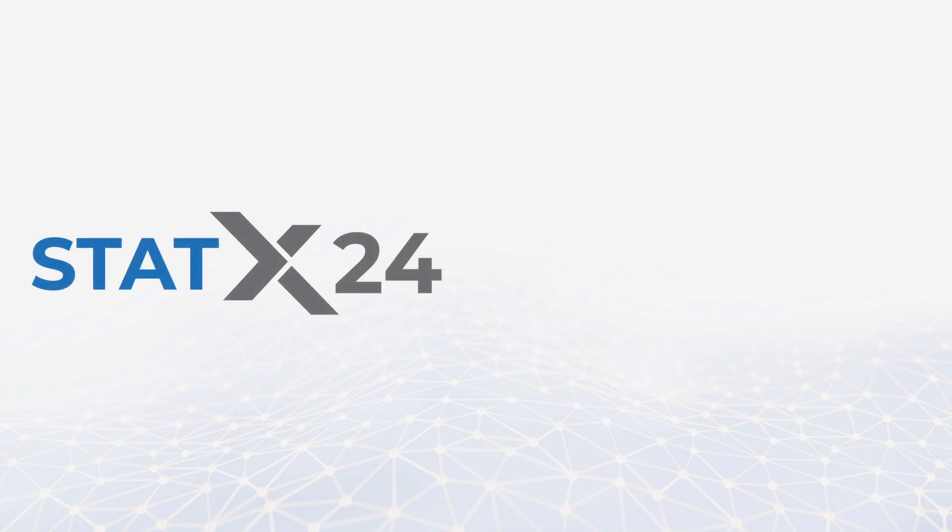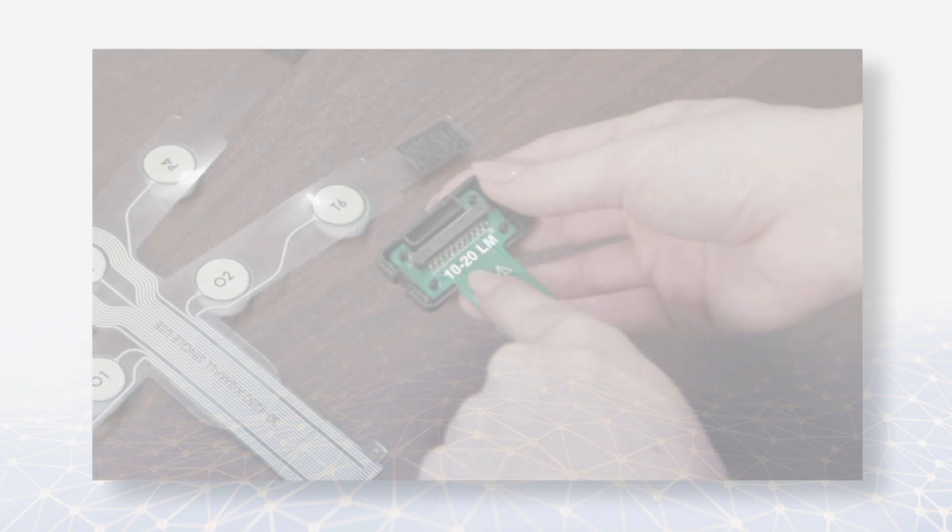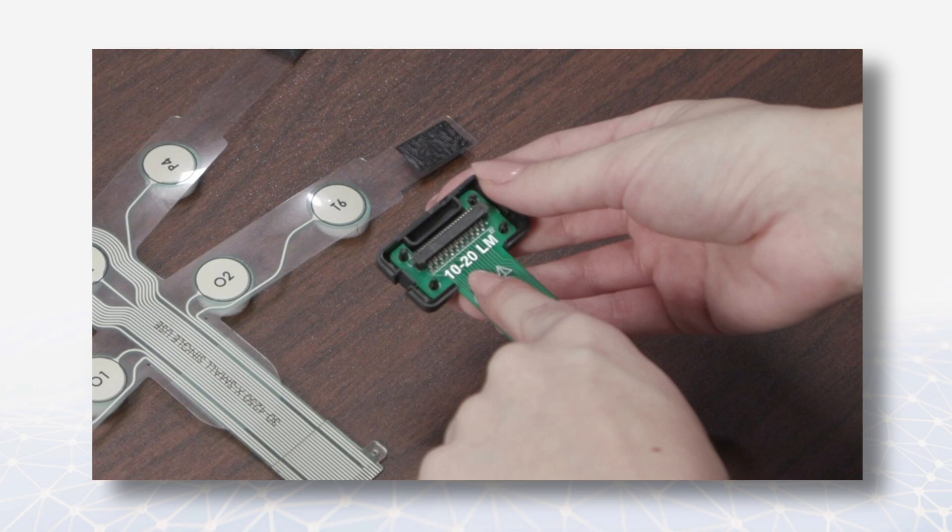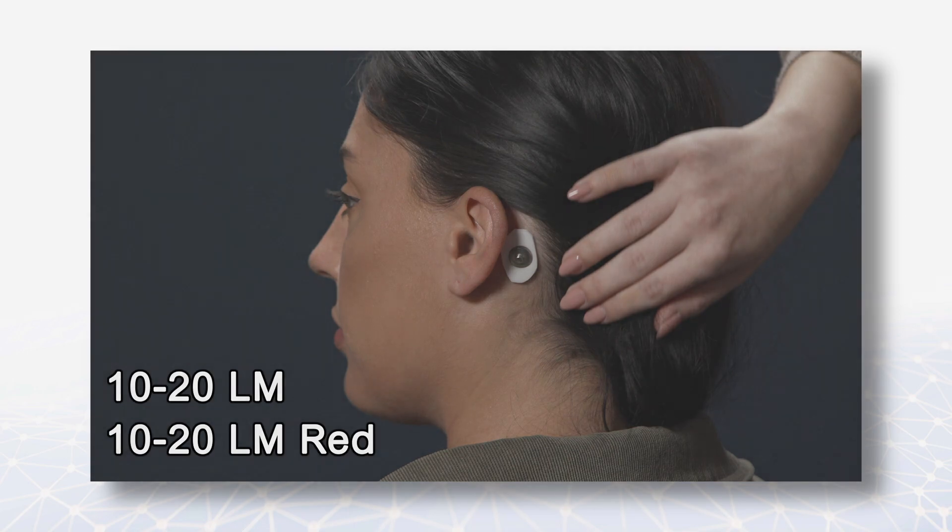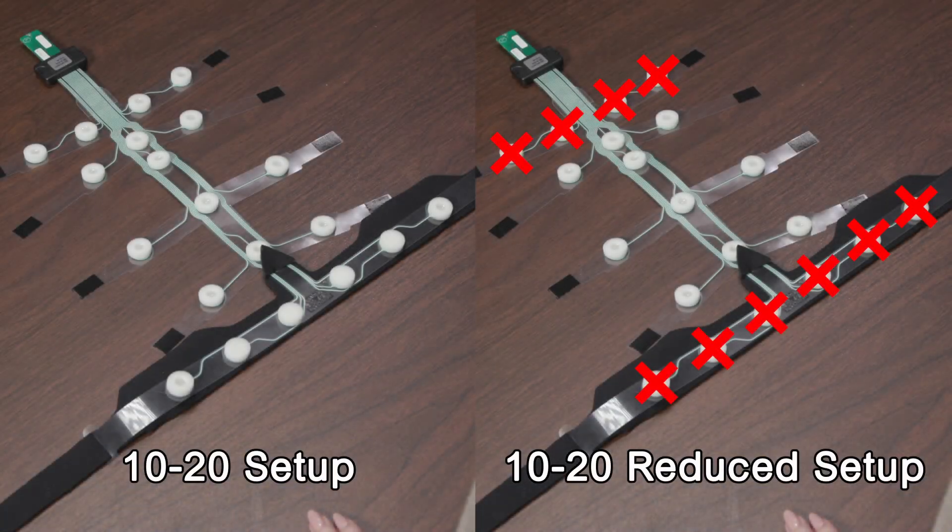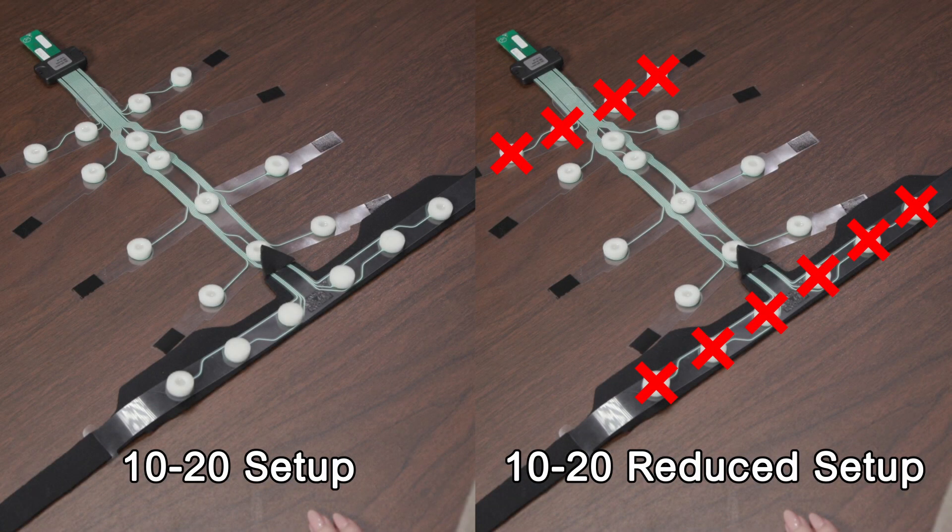ABM's X-Series system is marketed as a medical device under the STAT brand and as a consumer device under the BeAlert brand. Both function the same way. ABM's systems use a special adapter that connects the headset to the sensor strip allowing for different acquisition montages. Although there are some nuances between the different montages, the general setup is the same. This training is for linked mastoid montages, both the standard 1020 linked mastoid and 1020 reduced linked mastoid. The 1020 reduced setup uses the same strip as the standard 1020, but fewer sensor sites are used for EEG acquisition.